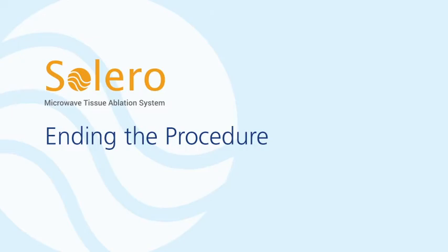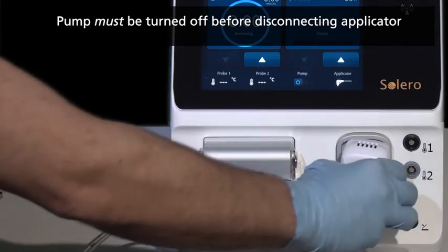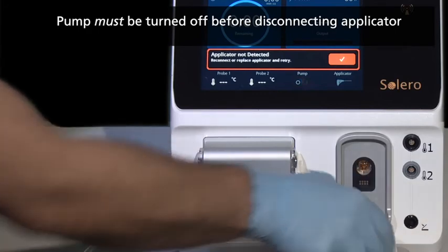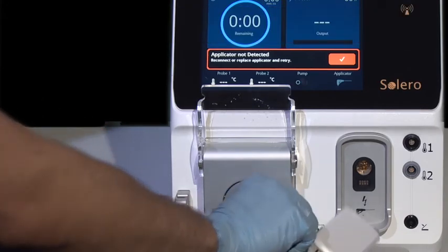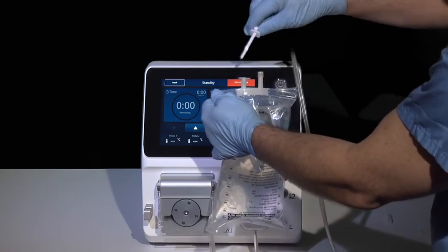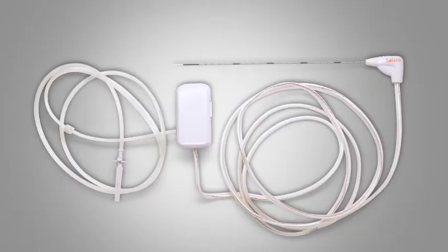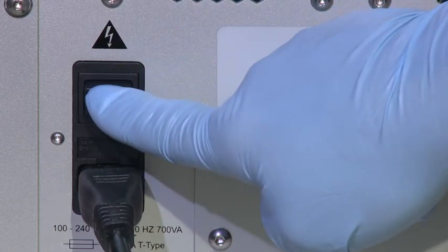Ending the procedure. Once the procedure is complete, remove the applicator from the patient. Turn off the pump and disconnect the applicator from the front of the generator by pressing the retention clips on both sides and pulling on the cartridge firmly. Open the pump housing door and remove the tubing set. Remove the spike from the saline bag. Dispose of the Solero applicator according to state and hospital policies pertaining to sharps and biohazard handling procedures. Finally, power down the system using the back panel toggle switch.